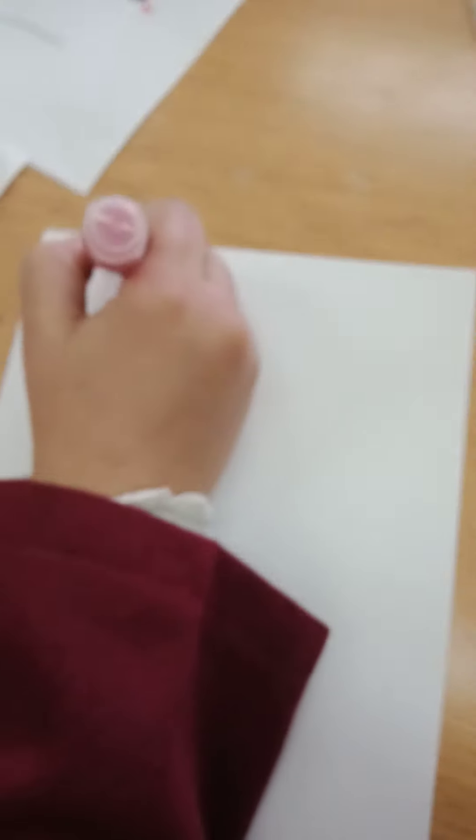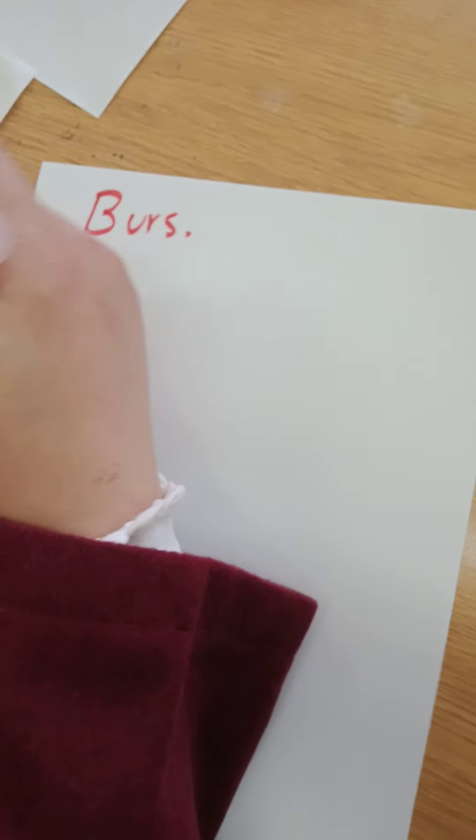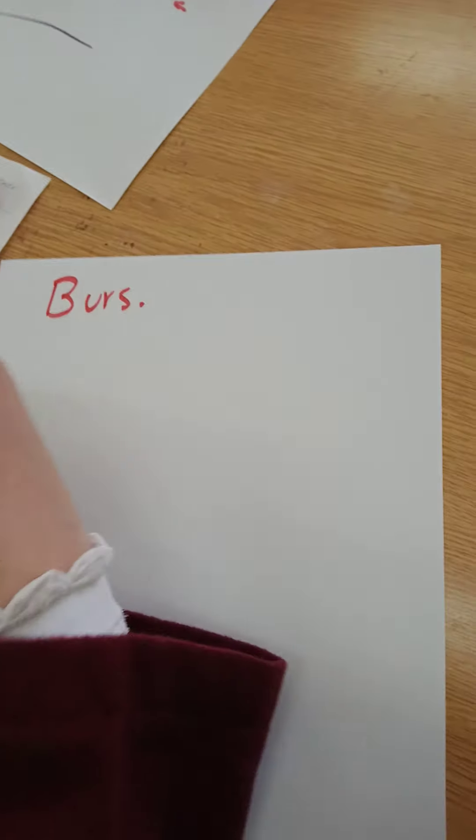In this video now we're going to talk about burs used in veneer preparations. What is the type of the burs we're using? Diamond. Usually diamond.